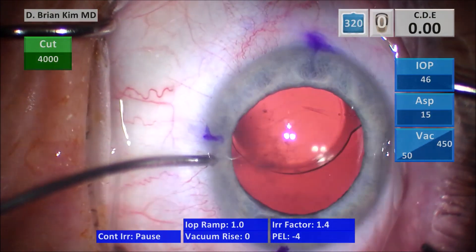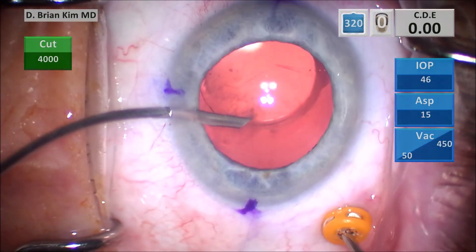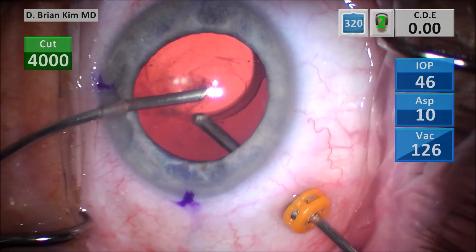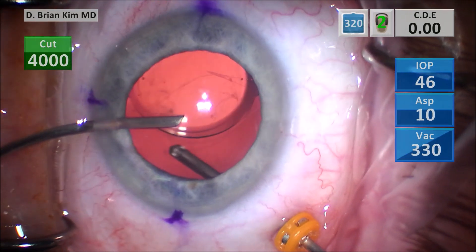You can see the infusion cannula has a bevel. This is a nice tip — I like to go bevel down, so I'm turning the cannula actually upside down. Bevel down makes it go through the corneal incision so much more easily without potentially traumatizing the corneal epithelium.